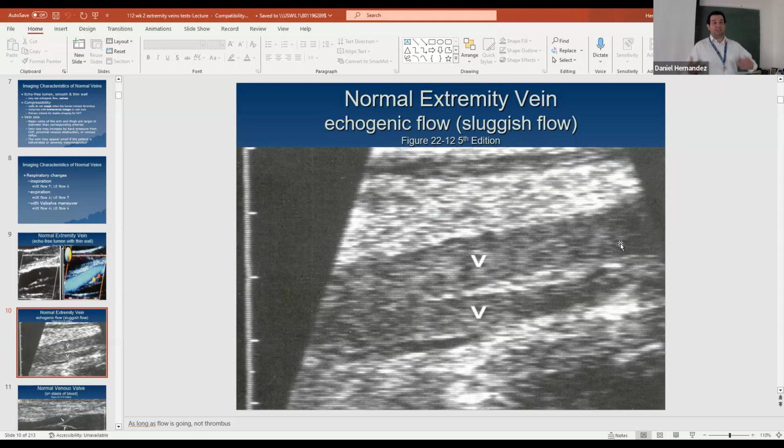Maybe the patient has venous congestion, caused by maybe a proximal clot blocking that blood flow. Maybe something's compressing the vessel higher up, causing that sluggish flow. Maybe it's due to inactivity or immobility. Maybe they've just got poor circulation at that point, leading to this stagnant flow.